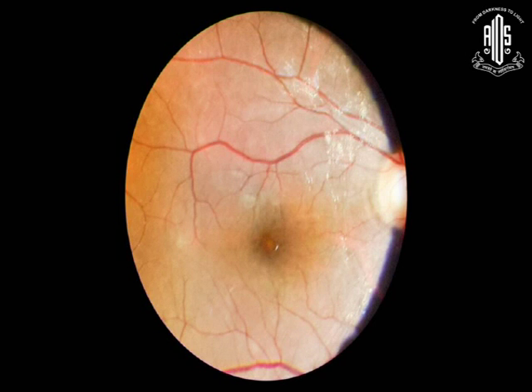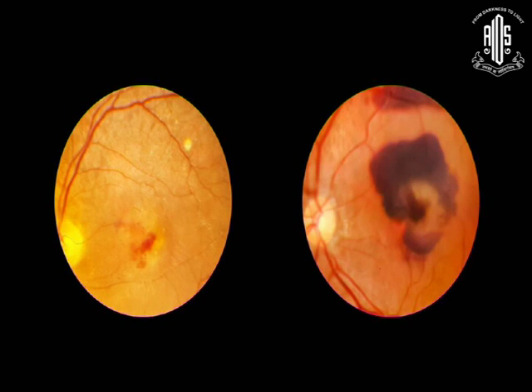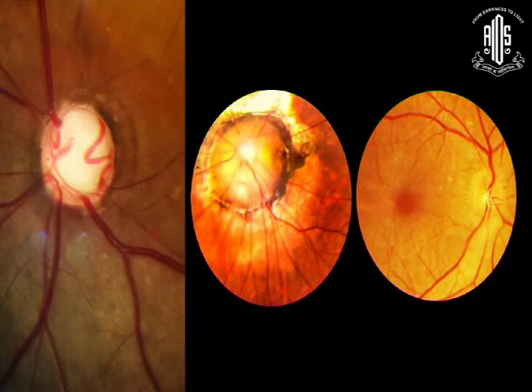Just to go through some of the images here, this is cystoid macular edema. You can see the flower petal appearance here, the changes of cystoid macular edema. And AMD, you can see some fine striae due to the exudative component here, the submacular hemorrhage. And disc photographs, glaucomatous cupping, morning glory. And if you look at this area, this margin is blurred. This is a resolving optic neuritis.